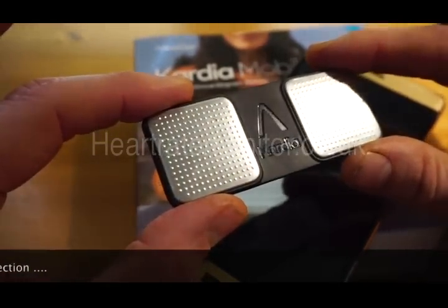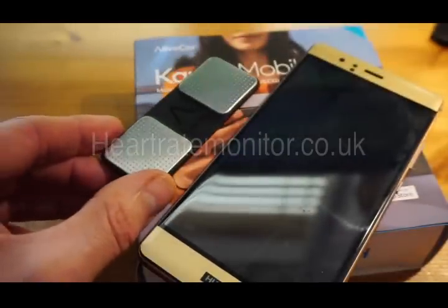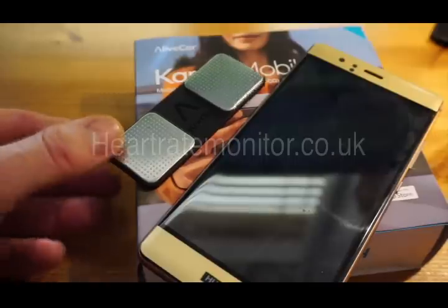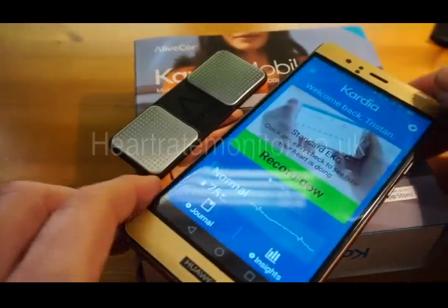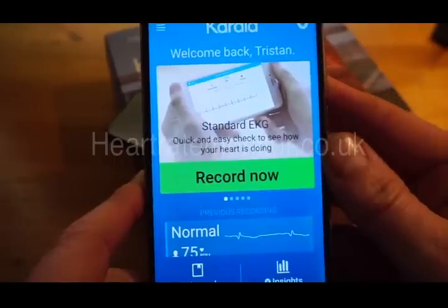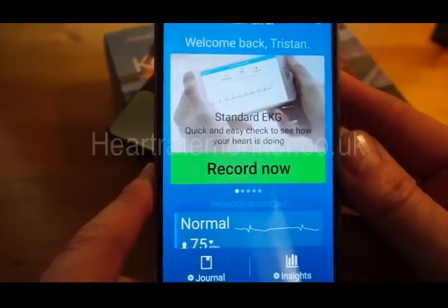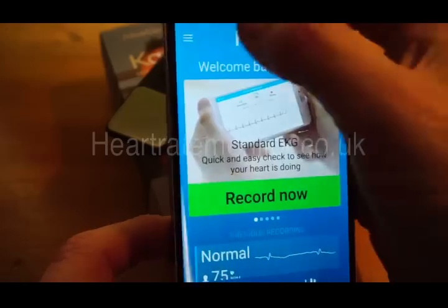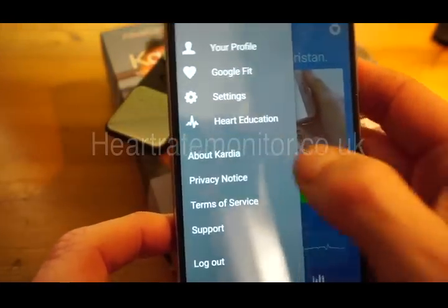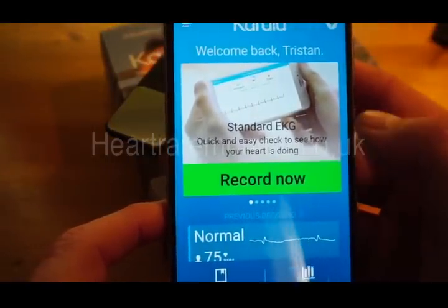I'm just going to go through what you get and how it works, and within a couple of minutes you'll have a full understanding of this great product. The app is very easy to install. I have an Android phone so this is from the Google Play Store, but it's also available on the Apple Store for iOS devices. Once installed and you've been through the initial setup, it's simple to use.